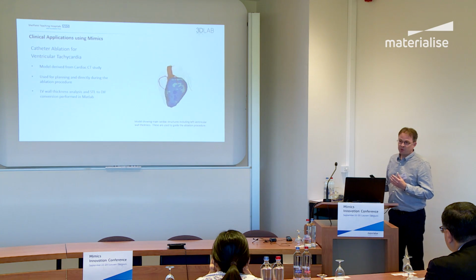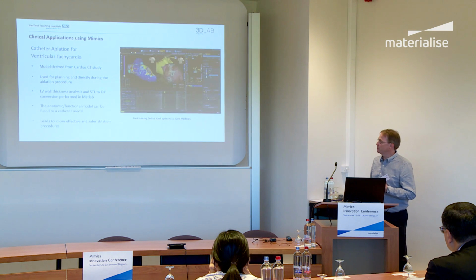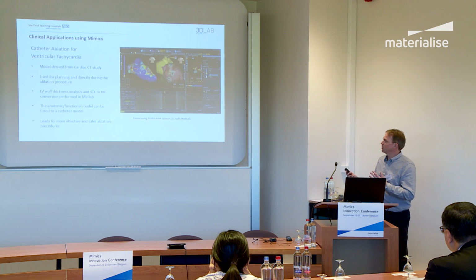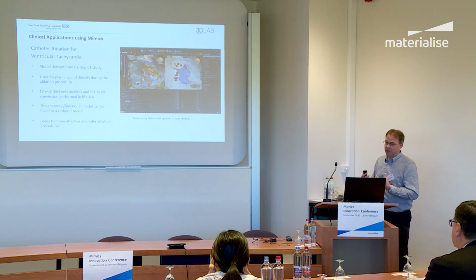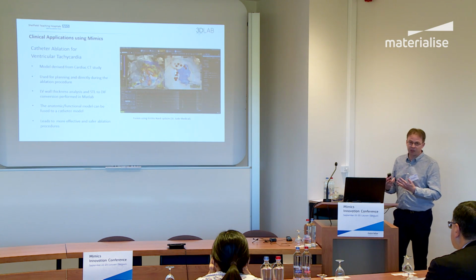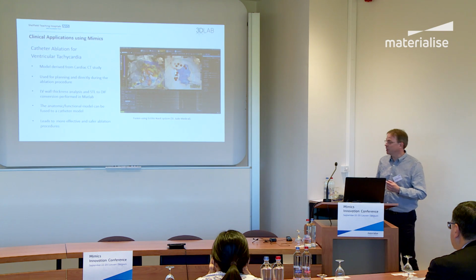And we've also developed some software to convert the STL from Mimics into a format that they can then load into their mapping system. So they've got the anatomical model fused to the model they generate during the procedure. And this gives them greater confidence as to where they're doing the ablation, but they can also target the ablation more appropriately to the areas which are more likely to have the issues.